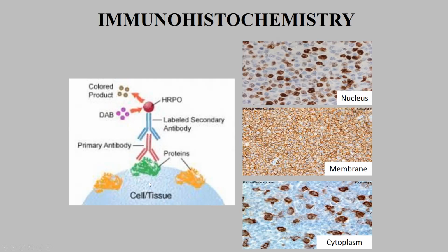But in case of presence of some marker, these products are located in a very precise place on these markers or this substance, and make some secondary reaction and visualization of this reaction, and we can see the presence of some biomarkers.